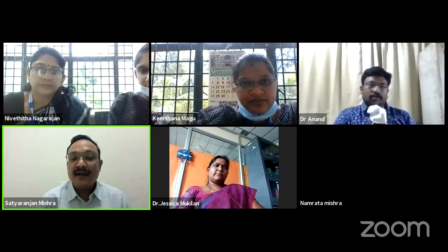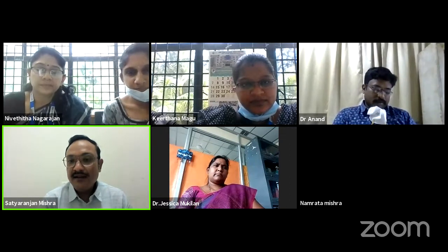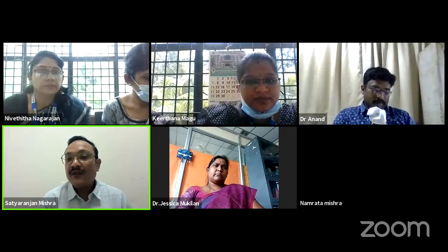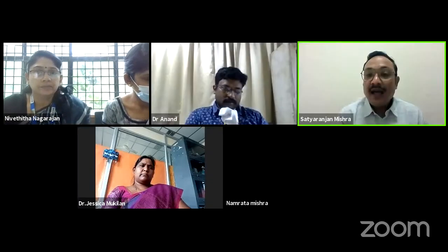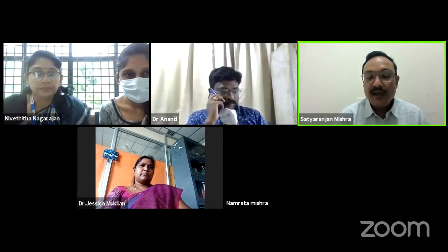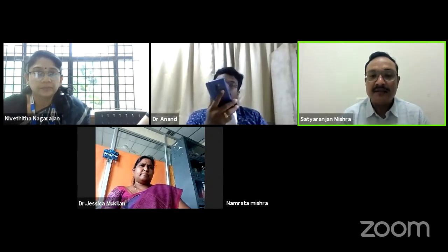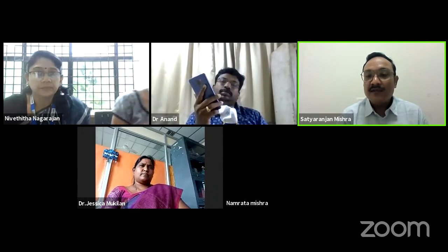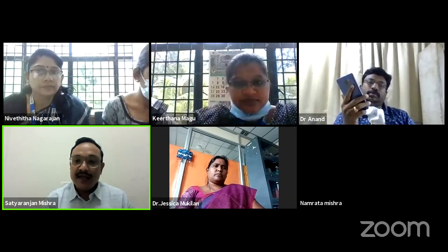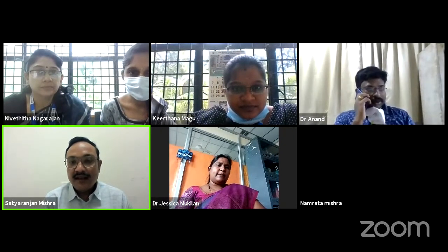So the idea is, as I've been insisting, the tooth has to be clinically appreciated. How is the condition of the tooth, whether it can be restored. If it doesn't have a lot of tooth structure, it needs to be extracted, then go ahead. Otherwise, of course, the diagnosis depends on the periapical changes. So if you have a lot of bone loss, it's an endo-perio lesion, then the treatment is dictated by the bone that is there.